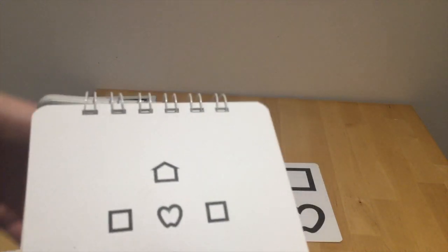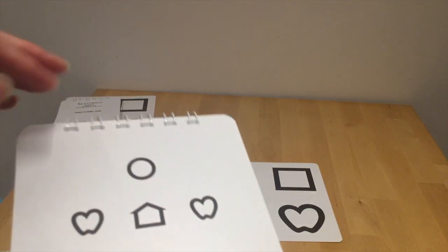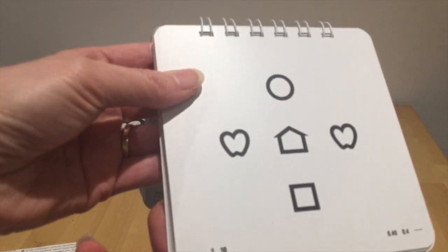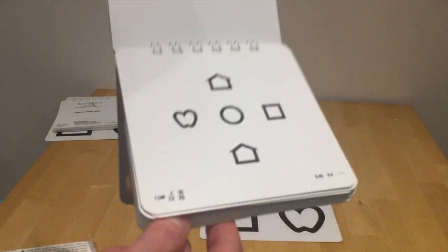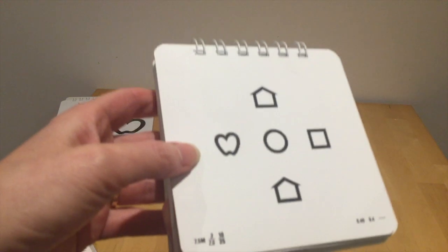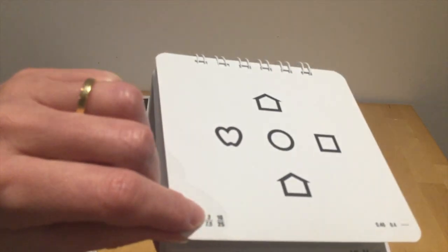So then what you would do is you would go back to your 7.5 because that's the previous size, and you'd go to the very first one in that size. That's still 7.5. That's 9.5. So go back to this one. Oh, remind me, what was the first one there? That's the heart or the apple.